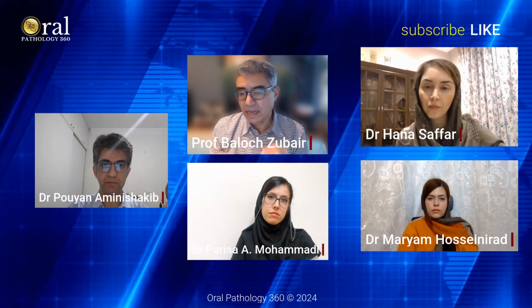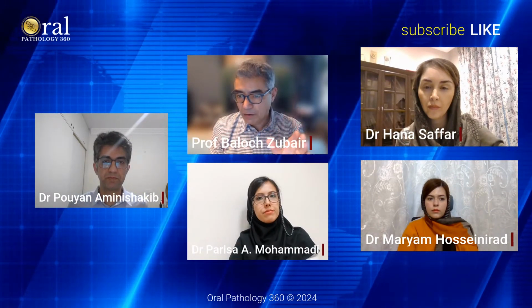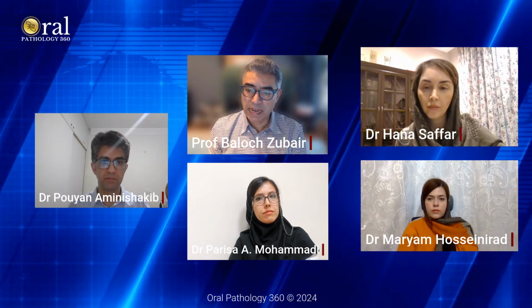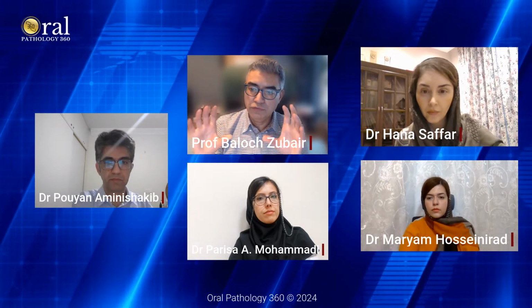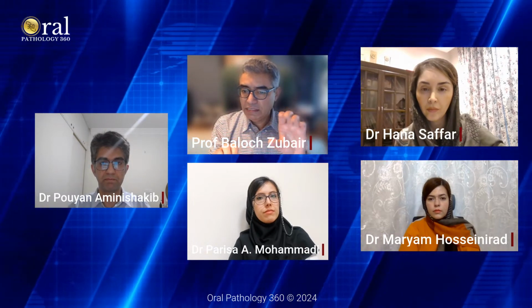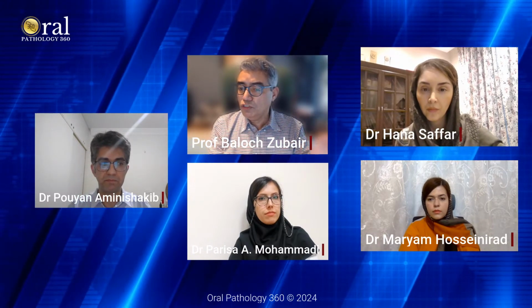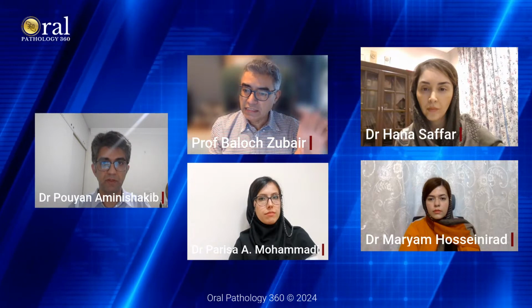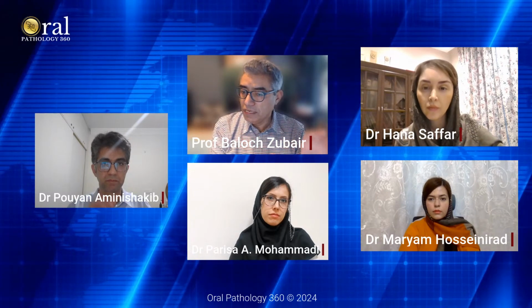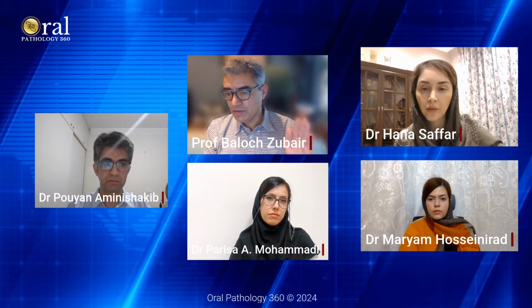So I think my algorithmic approach is to identify on site if you are looking at an outright neoplasm. At this point, I'm not worried about whether it's going to be malignant or benign. I want to create major food groups. For me, it's something that is neoplasm, something that is atypical, which means it sits between a non-neoplastic and a neoplastic one, or something which is very important: they are seeing a lesion, and what you are getting is just normal salivary gland tissue. To me, the FNA is non-diagnostic. Okay, so they are not able to get it. So to me, that is actually very important, right?